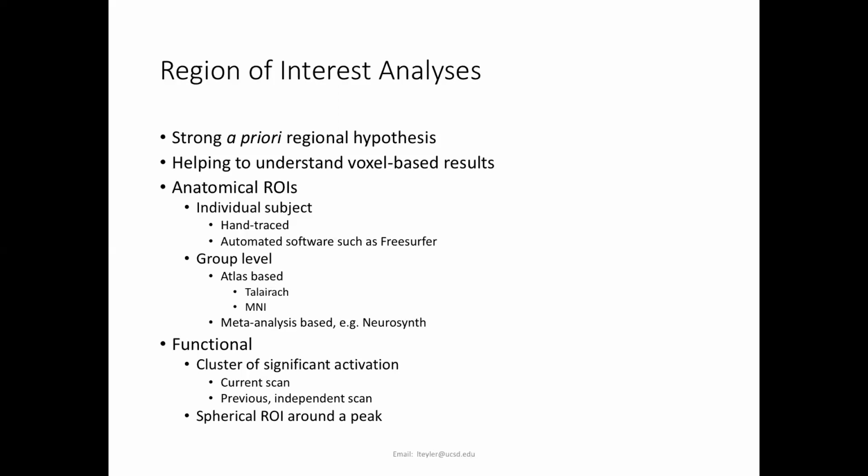And it will give you a map of language comprehension regions based on meta-analyses of many different papers out in the literature. And then you could apply that map to your own data and see what the group differences are within, say, the language region.